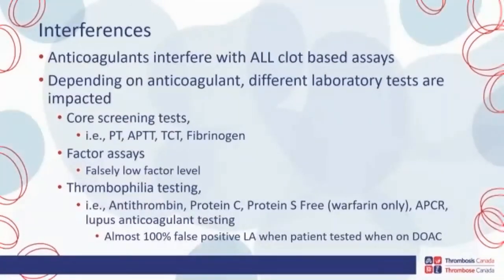dabigatran or an anticoagulant. And in fact, just yesterday we had a factors ordered and the patient was on dabigatran, and the technologist, rightly so, caught the dilutional effect, so we had to note it. The comment had to be written in order before it was released. So falsely low factor assays is a risk, as well as in our thrombophilia testing.